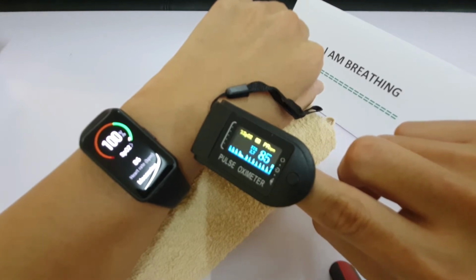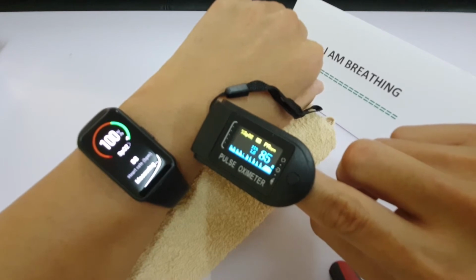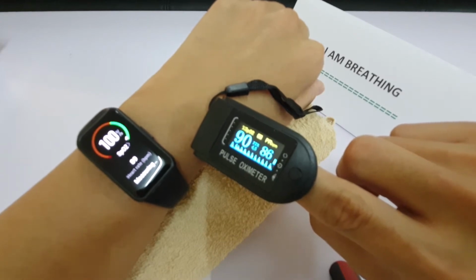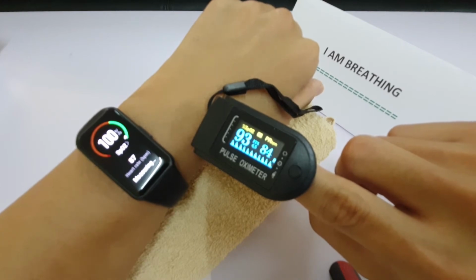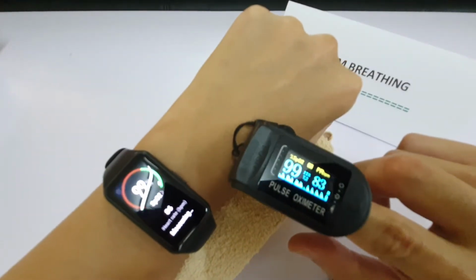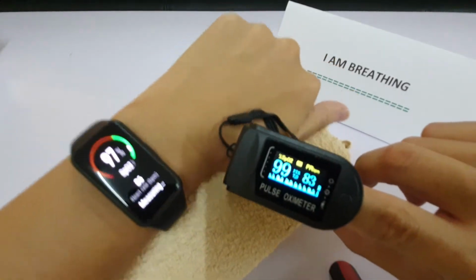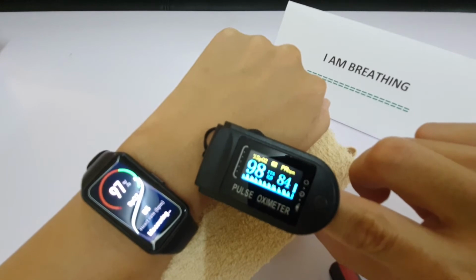Okay, so you can see my oximeter going up again. So that band is not measuring very well. So we're going to do it one more time, actually two more times. Right now we are stabilized at about 98, 99%, 85 beats per minute.